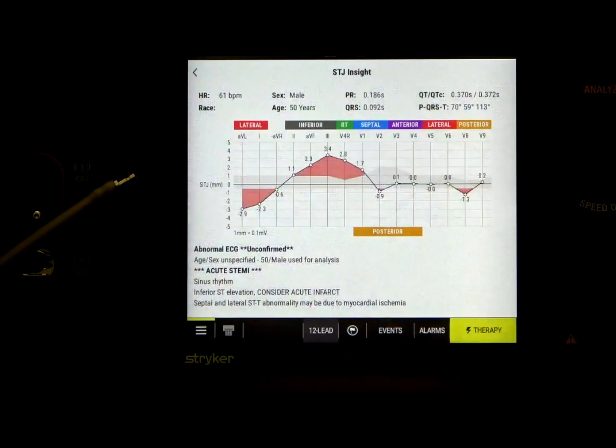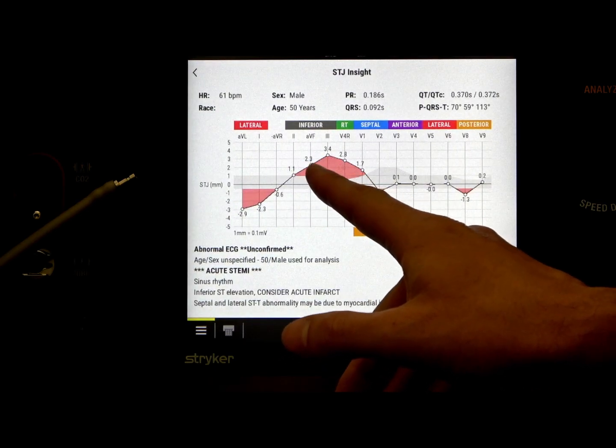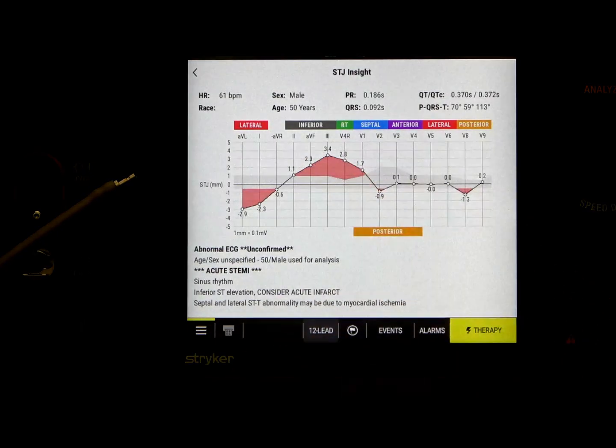Let's go ahead and hit the analysis tab, and that confirms that. You see red above the gray area under inferior and right. So right-sided inferior MI or STEMI. And this is clinically relevant for us, very preload dependent patient, and they should be treated as such.